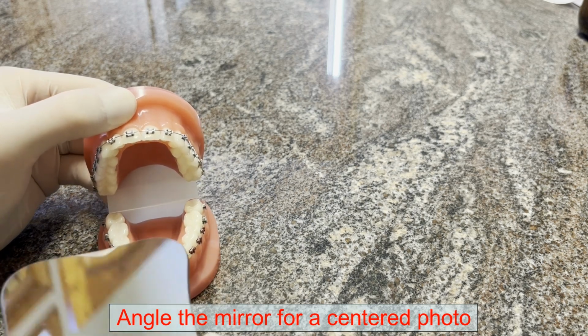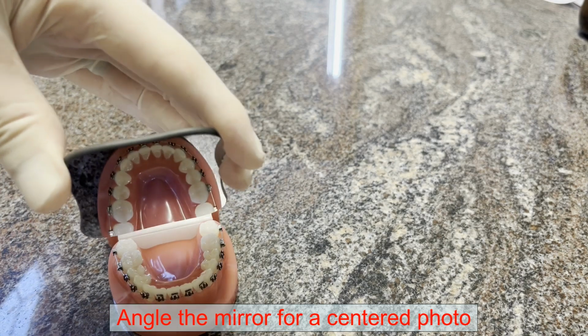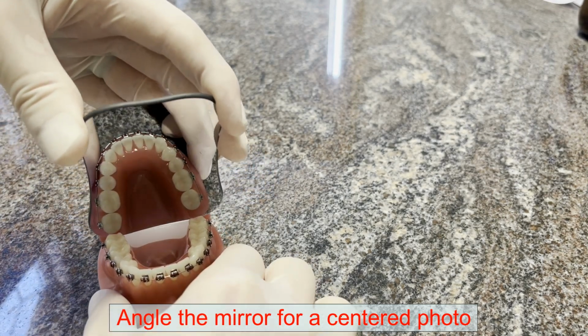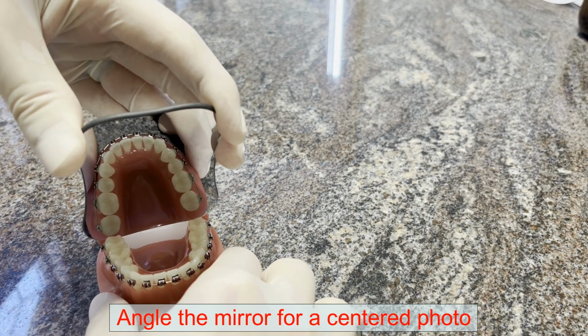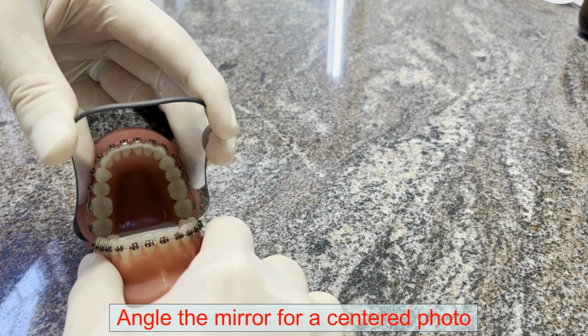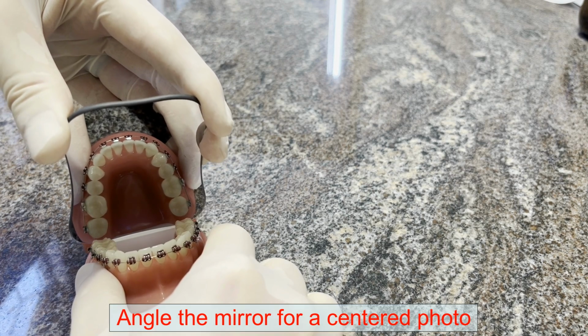And then same thing on the lower. When you go to get the lower shot, you'll have them raise their tongue up. You'll slide this back like that, and you have to get the mirror distal to the most distal tooth like that. And then you get the right angle and the right shot. So they'll be kind of like that, and then bang, just like that.